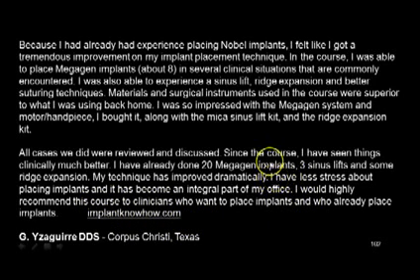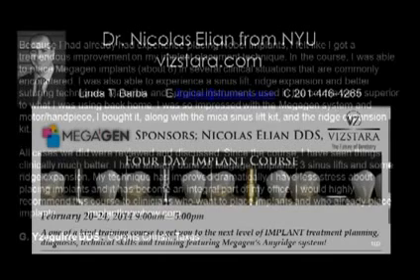Now, here's the point I want to focus on. Yes, he places Megagen now, and he's been able to place more implants because he has more tools in his armamentarium, and that's really the key. It says, I have less stress about placing implants, and it has become an integral part of my office. And that's really the key, because you're able to do more things with the AnyRidge implant. You're able to actually increase your patient treatment as well as the patient results and predictability. And that's really the key right there, because you're predictably able to do these procedures and get predictable torque, predictable primary stability, and predictable results.